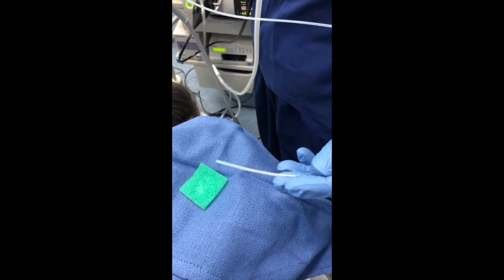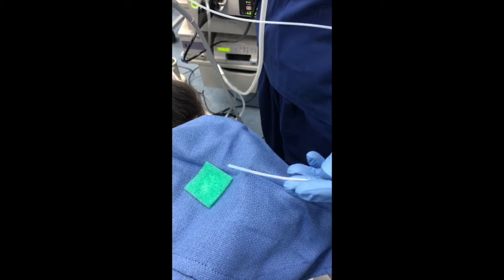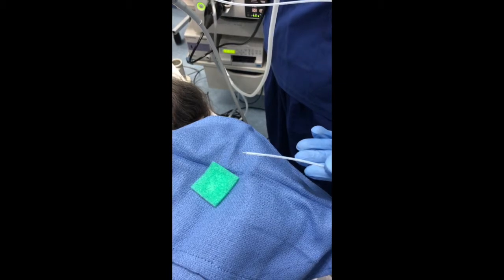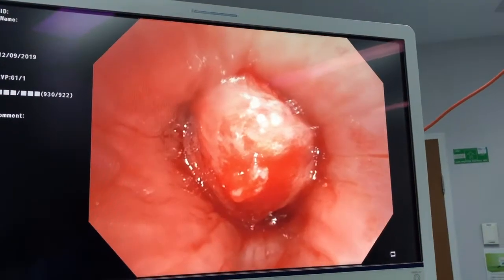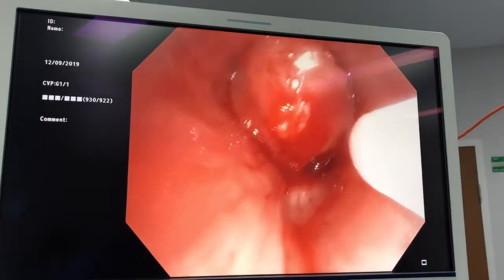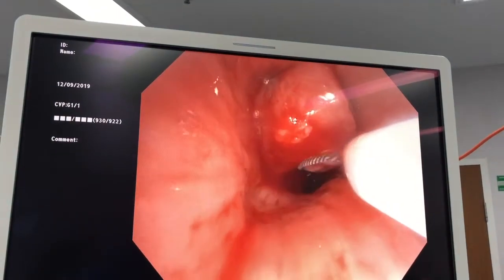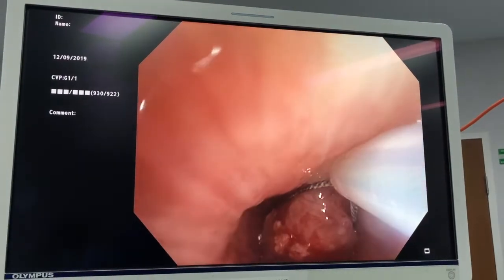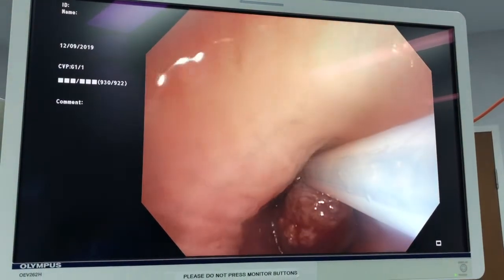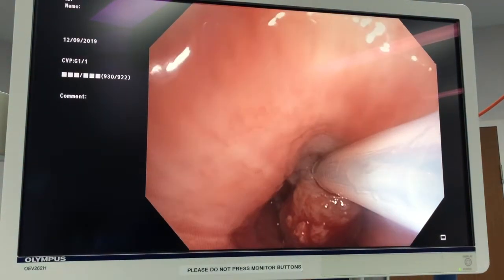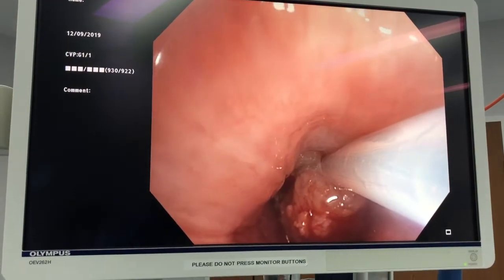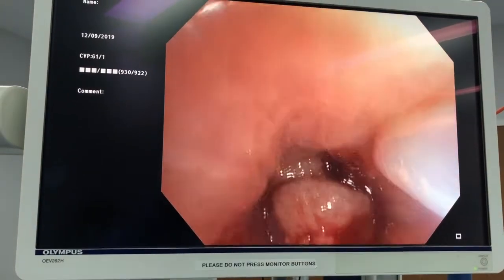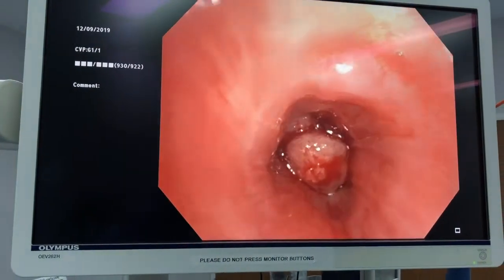This is the snare that we use. A snare is a wire loop that will come out the end of the catheter, and I run heat or electricity through that, which heats up and will cut through the tumour. So here we are back to the tumour, and we're going to put the snare out and loop around the tumour to be able to cut it. When I activate the snare, it will use heat energy to cut through the tumour. Now we're just cutting through it there, and there it's been released. I can now remove the snare.